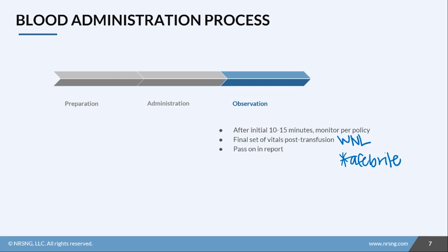And then, of course, we want you to pass it on to report because reactions can occur 24 hours after the transfusion ends. We also want to make sure that we're following up and getting a follow-up CBC, especially if your patient still appears unstable. Depending on which blood product you gave your patient, the provider will want the CBC at a different time. In general, if we're giving our patients a unit of blood or of packed red blood cells, they're going to want it about 2 hours after the transfusion.